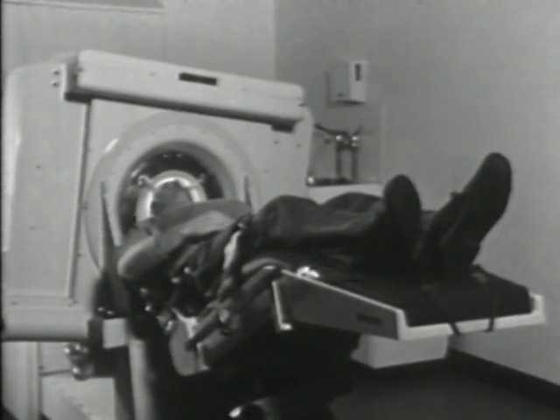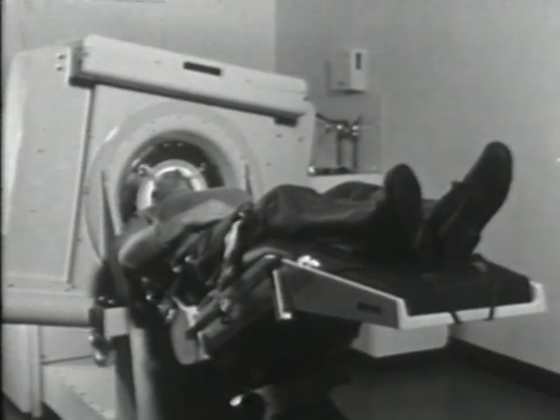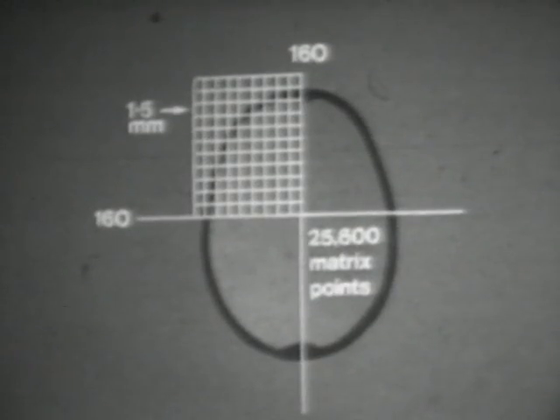Projections are obtained by measuring the attenuation of X-ray photons across the slice from a large number of sequential, exactly corresponding points around the circumference. A computer is used to assemble this information and arrange it in a form suitable for use in a series of mathematical operations. This series of mathematical operations or algorithm is then used to effect the reconstruction of the anatomy of the slice.